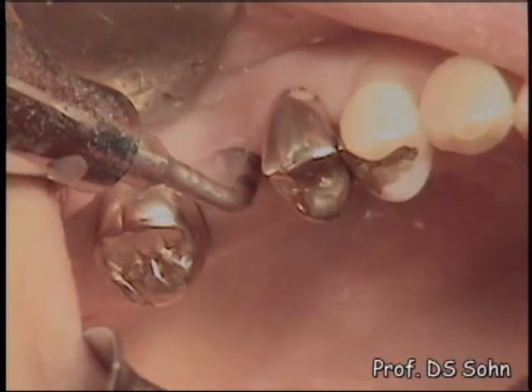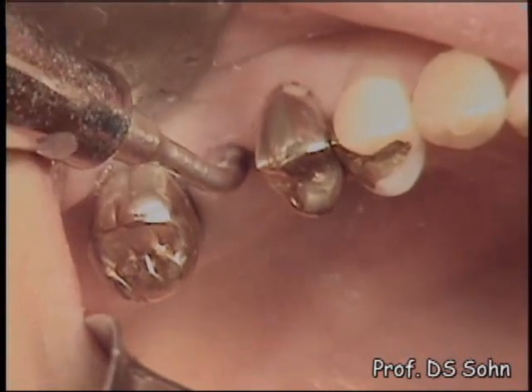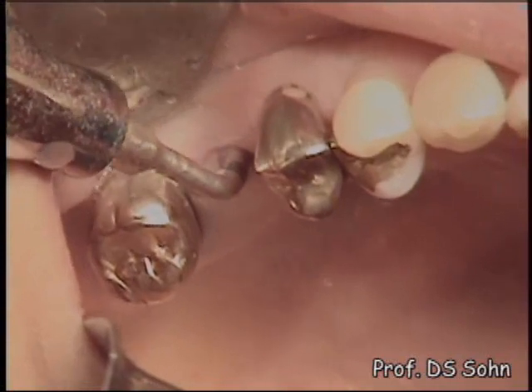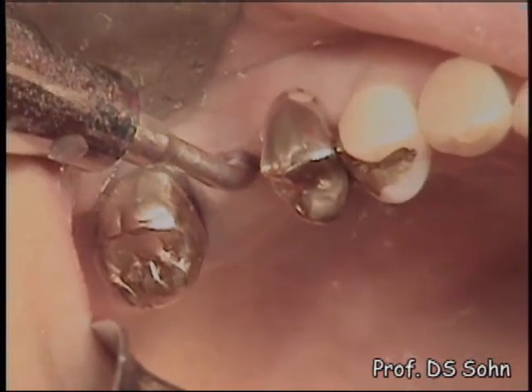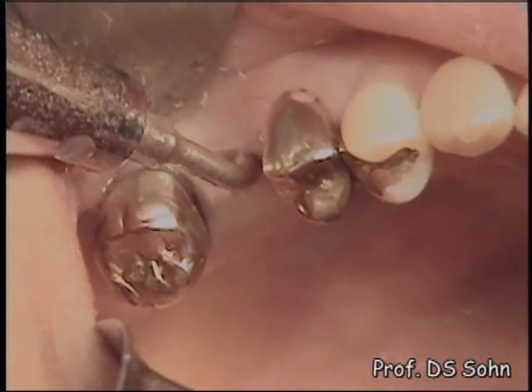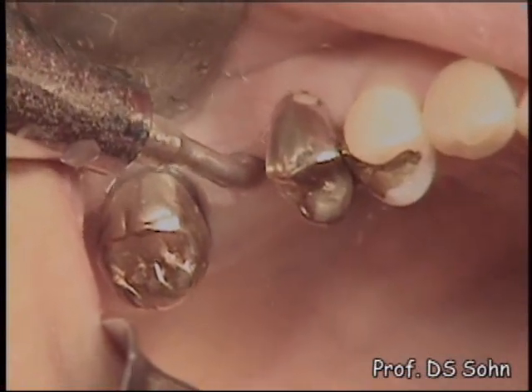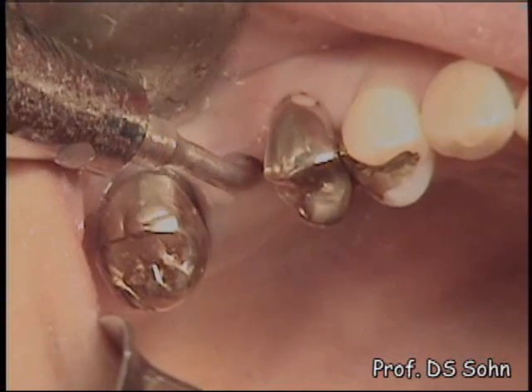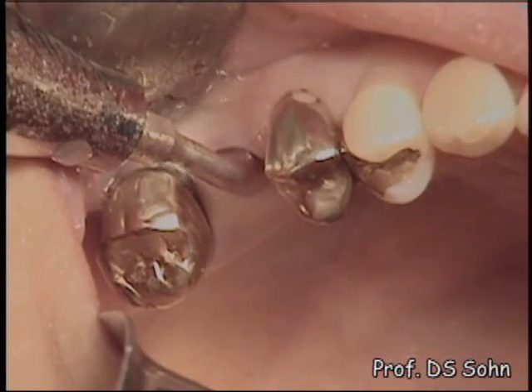The 2.8mm wide HP step was then used to advance the osteotomy to and through the sinus floor. Hydraulic pressure was applied for a few tens of seconds to gently elevate the membrane. The sinus floor was broken with the HP step. Please note the water coming out from the sinus cavity after elevation of the sinus mucosa.